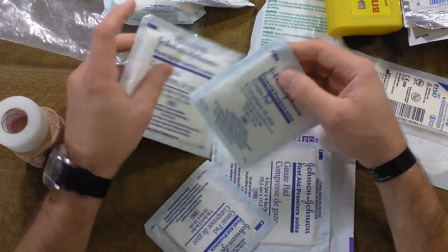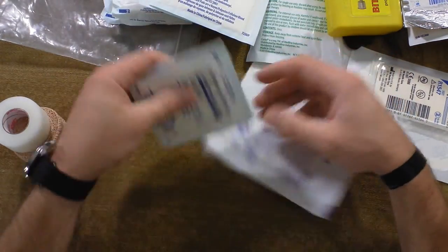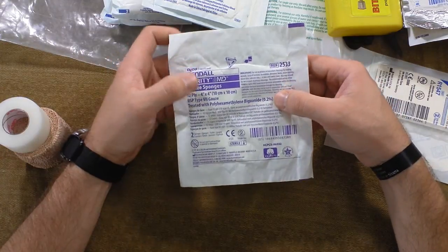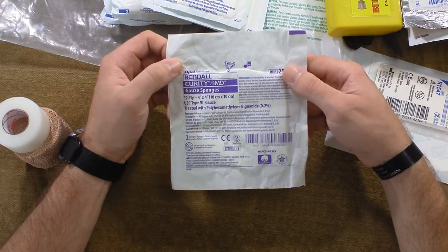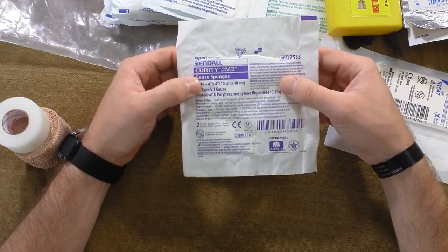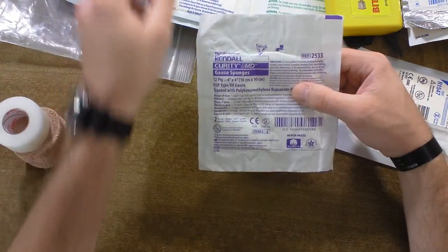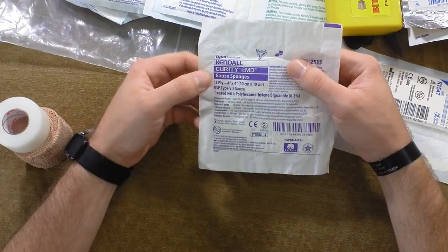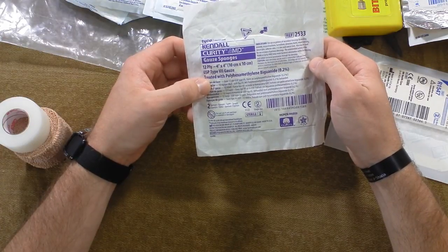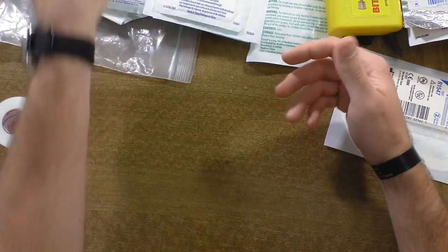I have a bunch of different gauze: smaller 3x3s, 4x4 gauze pads, and another 3x3. I also have one treated with a solution - this is another advanced gauze sponge by Kendall, a 4x4. It's going to be a little better than a basic dry surgery pad because it's impregnated with 0.2% polyhexamethylene biguanide, which will be a lot better for you than just putting a dry pad on there.